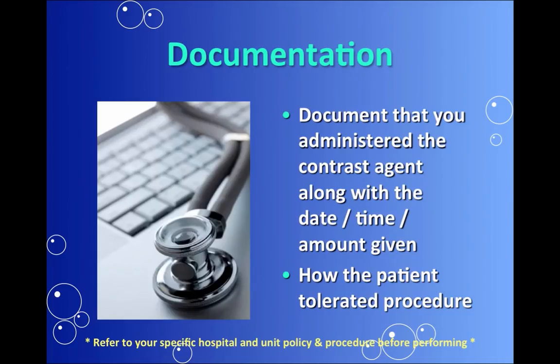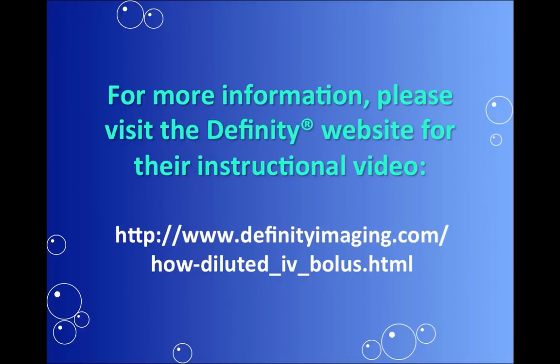As with any procedure, make sure to document all of the pertinent information, including how the patient tolerated the procedure and the amount of Definity given. For more detailed information on how to administer Definity, there's a great tutorial video at the link listed below.